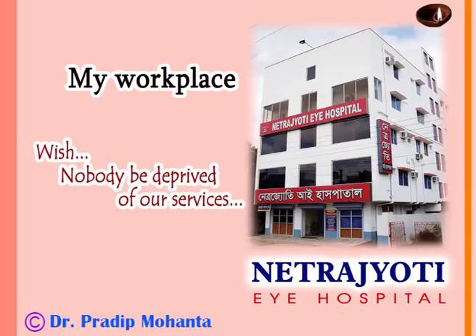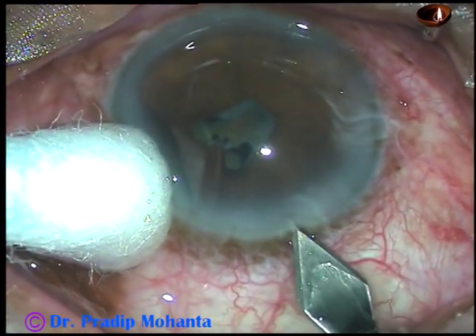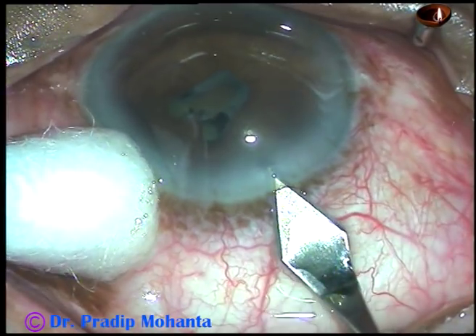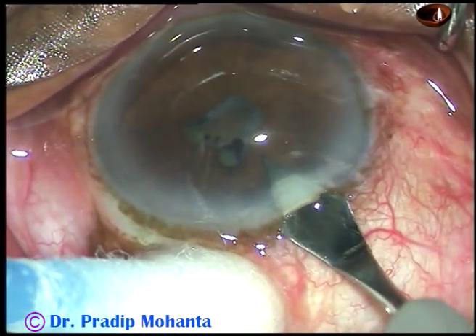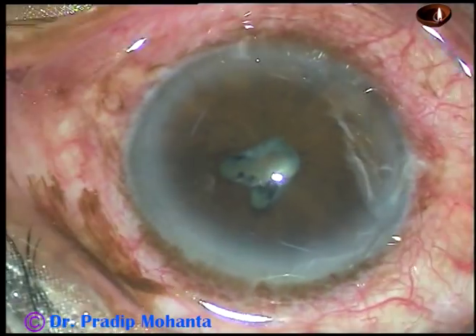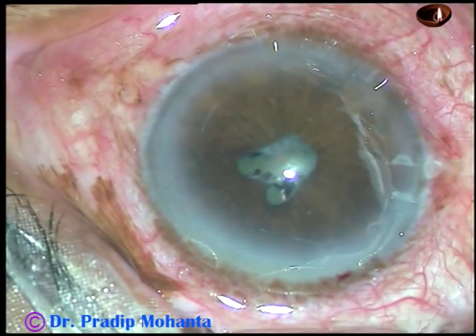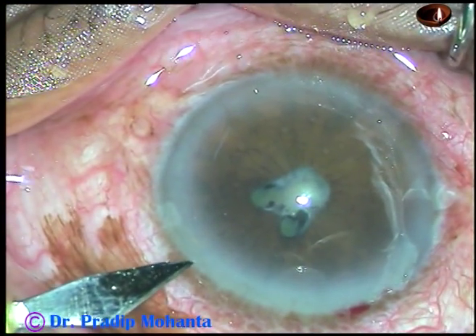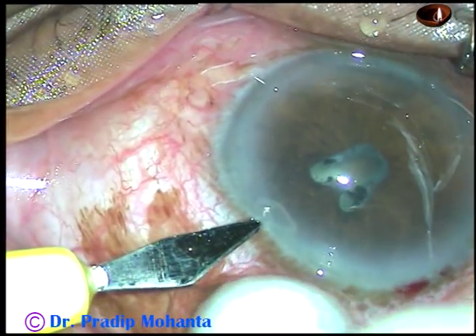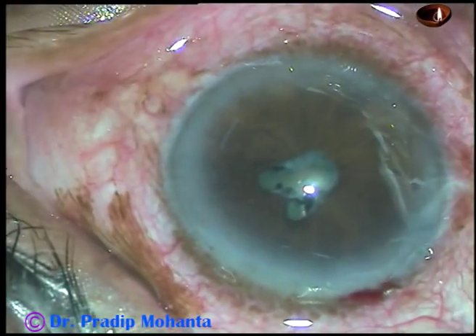Friends, welcome to my workplace at Rana Ghat, West Bengal, India. This is a hard brown cataract with the patient having more than 200 degrees of posterior synechia and a thick, strong, fibrous membrane. There are two gaps, one at 3 o'clock and another at 1:30 o'clock. Let us observe some salient steps of this surgery.